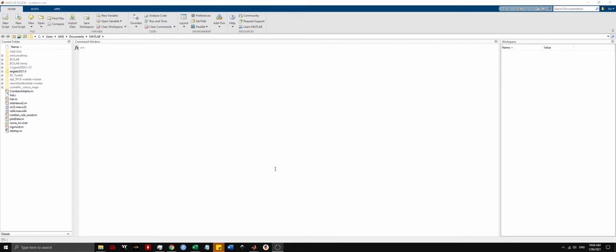When we're pre-processing data, there are two main goals. The first goal is to reduce the noise in your data so that you can see the effects of interest more clearly. And the second is to get your data in a format that's appropriate for measurement and statistical analysis.